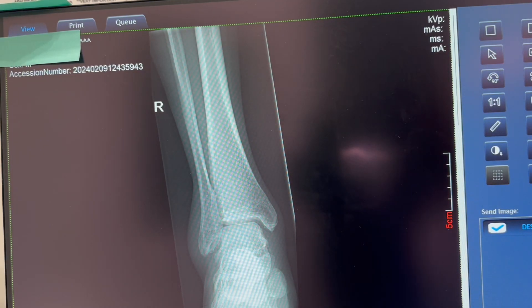Hey everybody, this is Eric again. I'm just going to do a quick ankle series critique so we know what we're looking for when we take an ankle x-ray. Ankles are one of those we do quite a bit. To start with, we're going to start with an AP ankle. The ankle series consists of an AP, an oblique or mortise view, and a lateral. Here we have a right ankle.